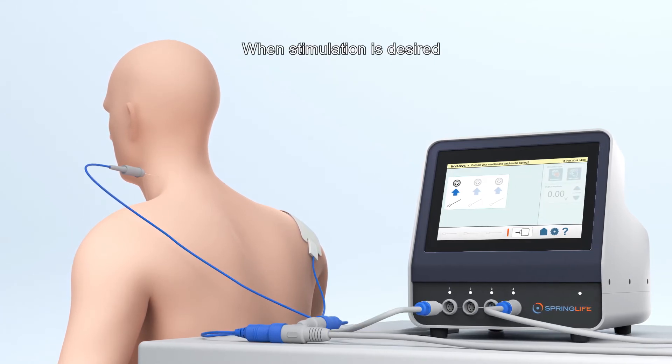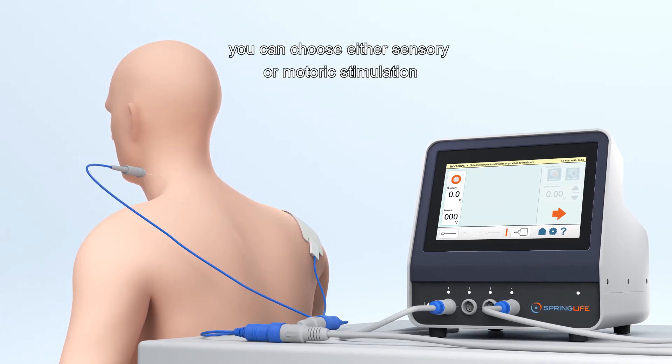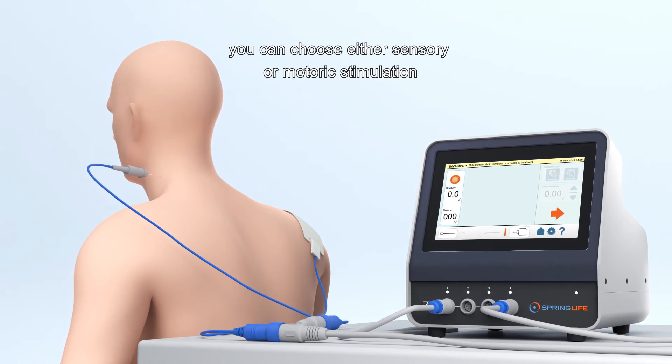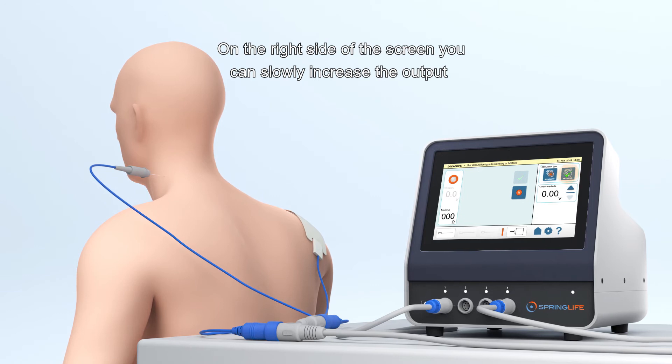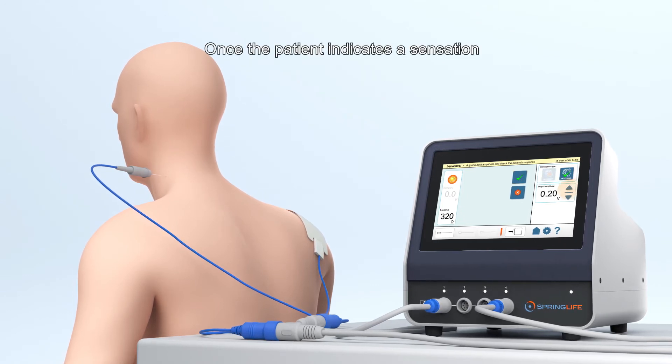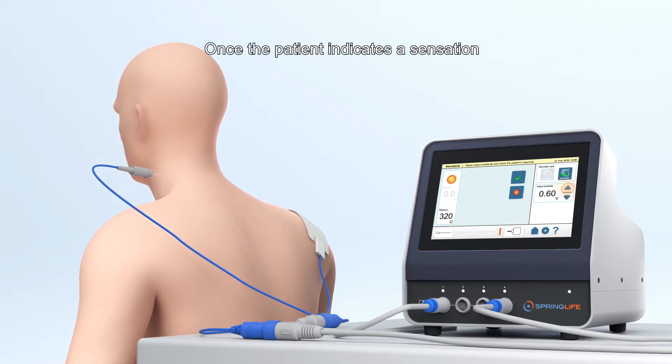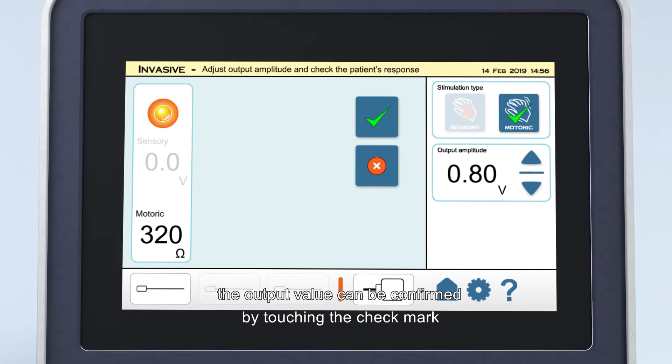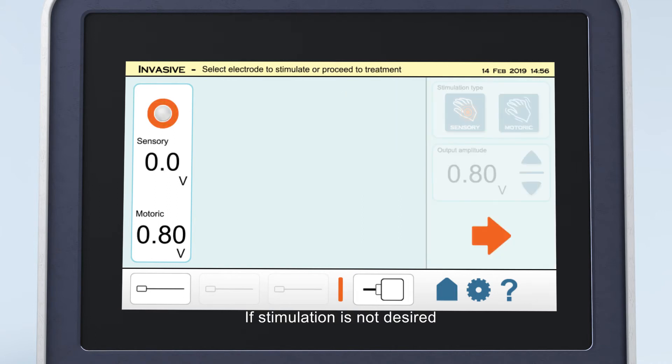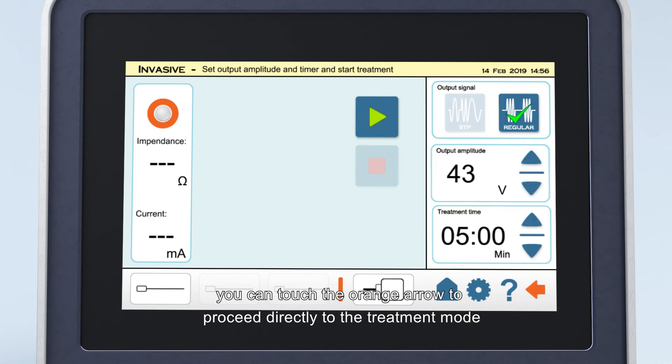When stimulation is desired, you can choose either sensory or motoric stimulation. On the right side of the screen, you can slowly increase the output. Once the patient indicates a sensation or a motoric reaction is noticed, the output value can be confirmed by touching the check mark. If stimulation is not desired, you can touch the orange arrow to proceed directly to the treatment mode.